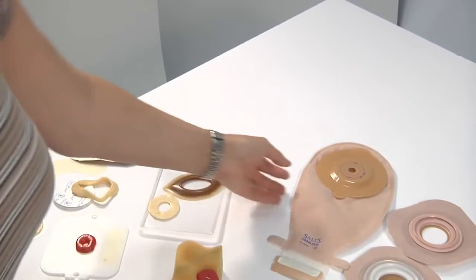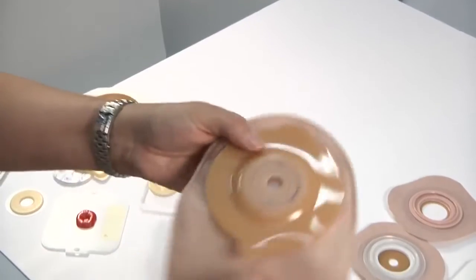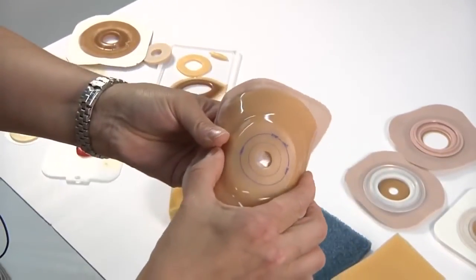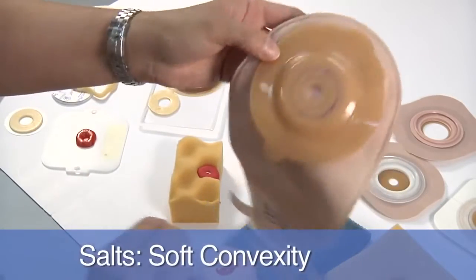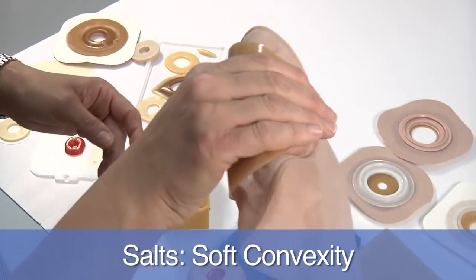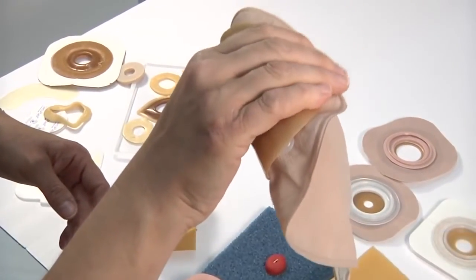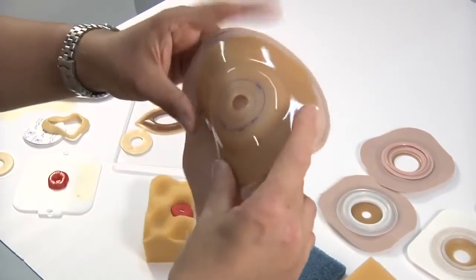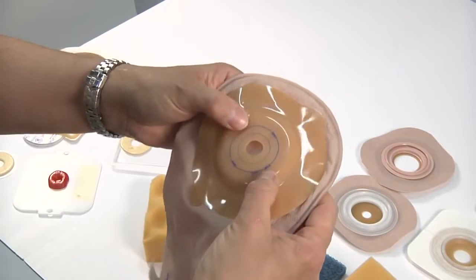The next level of convexity would be what we call integrated, where it's actually built into the barrier or the pouching system itself. So this one's from Salts, and this is what we call soft convexity. And as you can tell, this has actually got a lot of flexibility to it. You can actually distort it with your hand so that it would actually go into a crease or a gully.